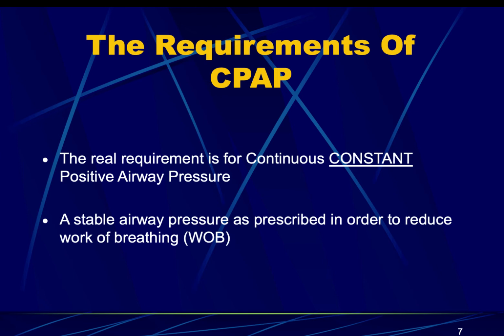And I think that's really what changed the protocols for us with CPAP, specifically with most of the medical directors and the medical control board here in town. CPAP will save somebody from actually being intubated. Okay, it's a very wonderful tool.